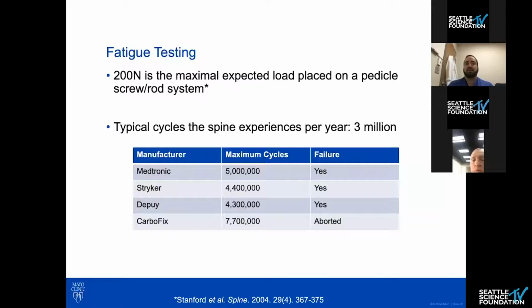So is this perfect? We don't know. No one's actually tested it far enough out to see if it breaks. But the way that carbon fiber manufacturing is performed is that individual fibers of carbon fiber are laid down with different vector directionality. So it's not a homogeneous vector that can eventually break if you fracture enough of the fibers, but rather there are opposing and non-correlative vectors to be able to withstand extra load.